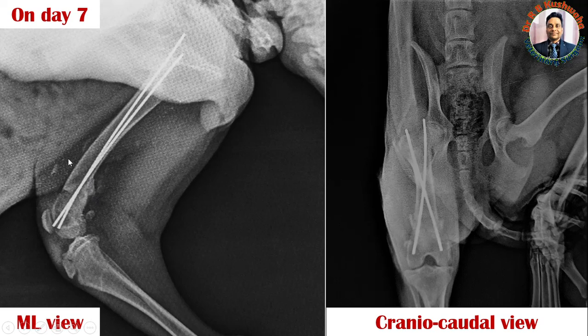Although on day seven it is very difficult to appreciate radiographically whatever changes occur in the bone, we could still appreciate a little bit of callus formation. Overall, the position of the bone is very good.